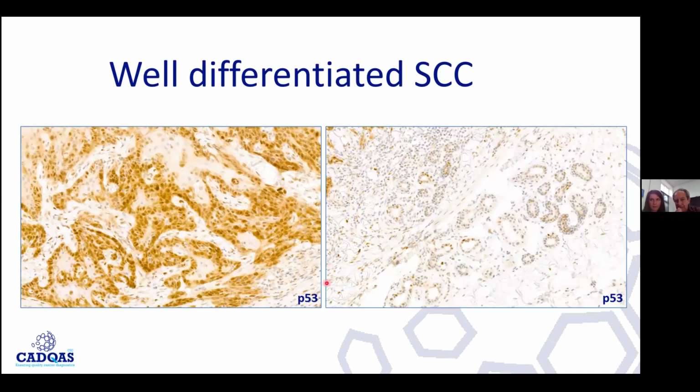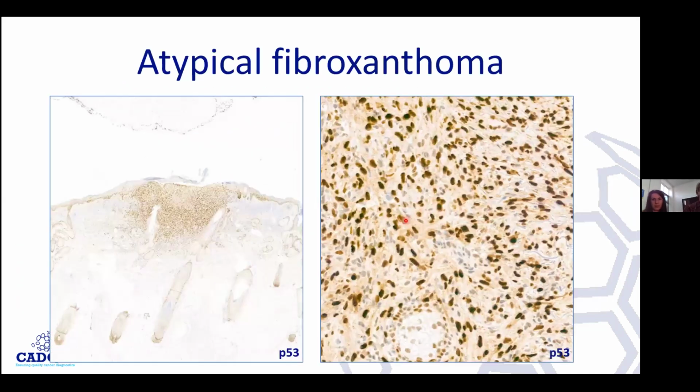Should we stop for questions? No, we have another 4 minutes. And this is to show that actually you don't have the background cytoplasmic staining.